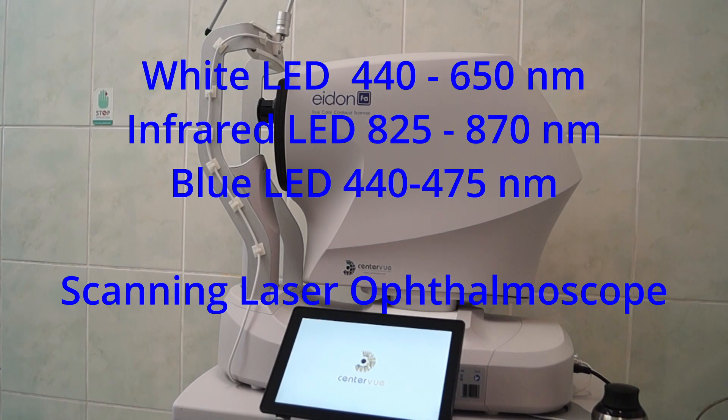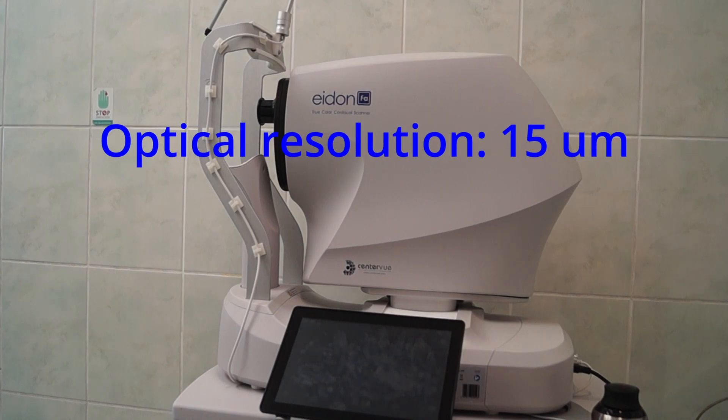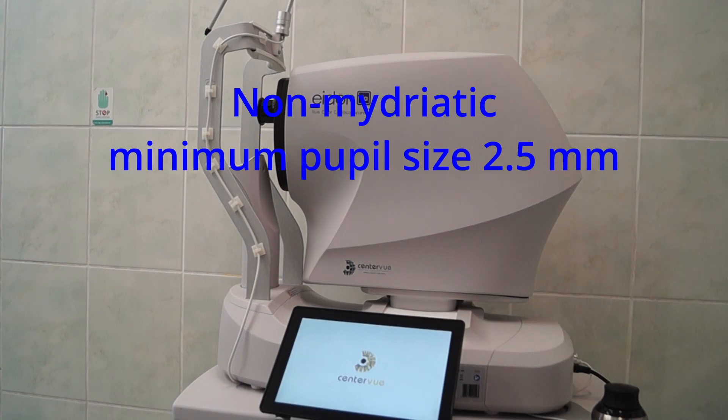There are three light sources: for autofluorescence, fluorescein angiography, and true color fundus photography. It has a 14 megapixel sensor that gives 15 micron optical resolution. This is a non-mydriatic fundus camera, so you don't need to dilate the pupils. The minimum pupil size listed is 2.5 millimeters, though in practice we were able to image at 2.0, even 1.6 millimeters.